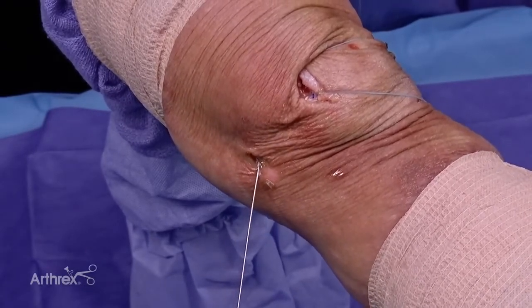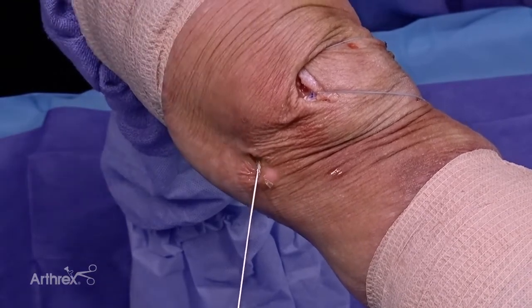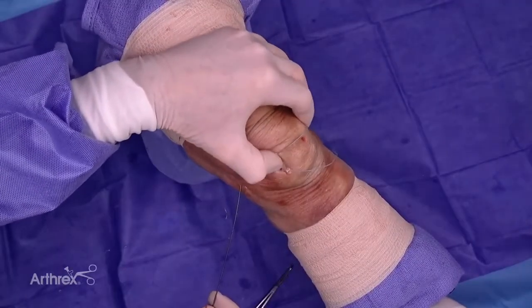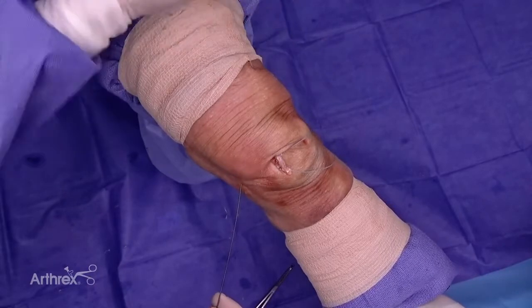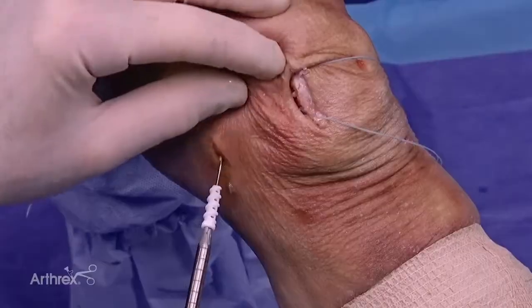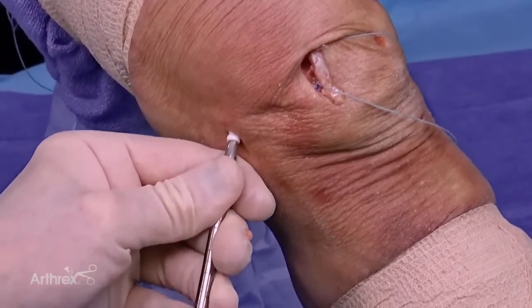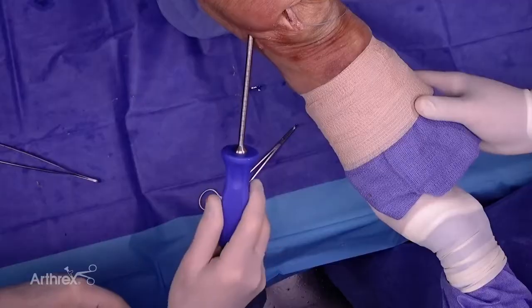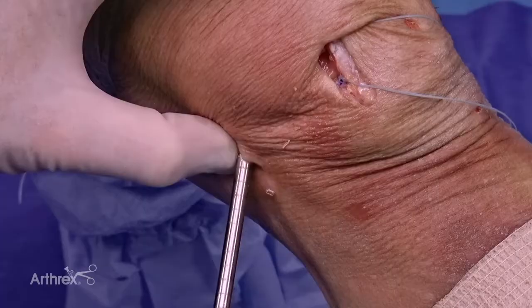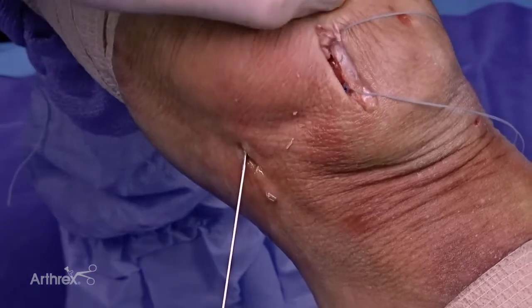For fixation position, I don't like to put any pressure on these sutures. I position the knee at 30 degrees of flexion and line up the lateral edge of the patella with the trochlea — it just finds itself tensioning. I don't really pull on these sutures at all. Here's our biocomposite fast-thread 6-millimeter diameter screw, 20 millimeters long, passing it over our nitinol wire. I secure the screw — I can feel the squeak — and there's our fixation.